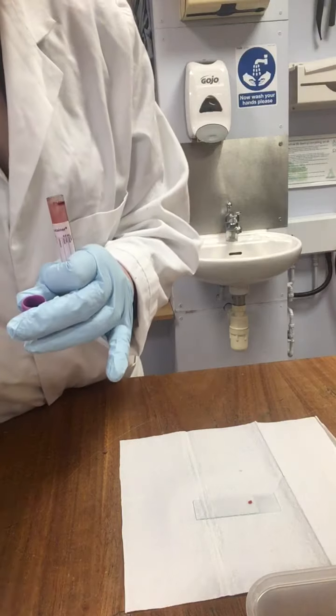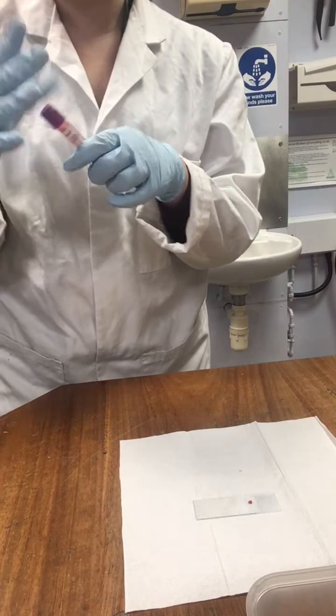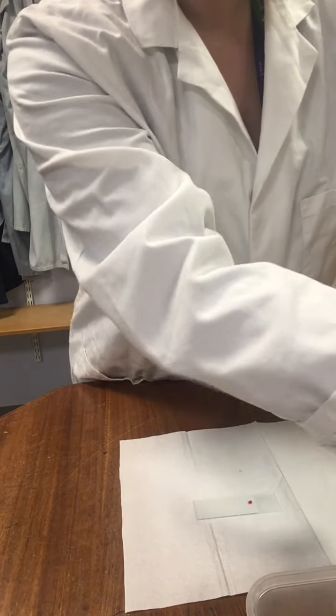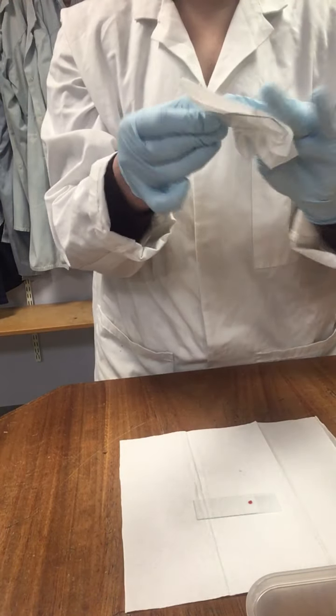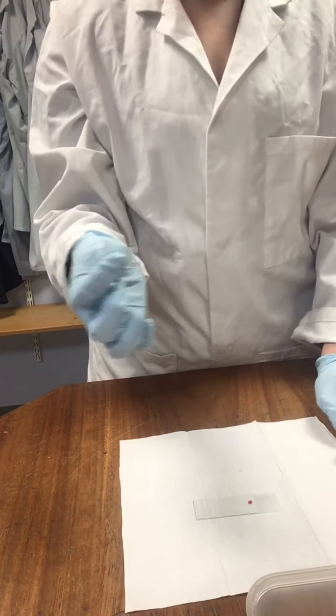And again, pop the remainder of the blood in the sharps bin in this instance, and just pop your lid back on your blood sample. So then taking another slide, which we are going to give a clean as well, just to make sure that again there's no grease on this particular slide. This is going to become our spreader.